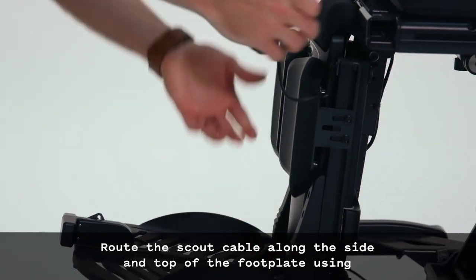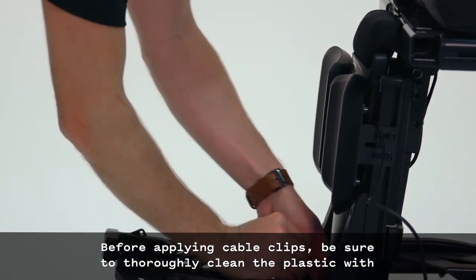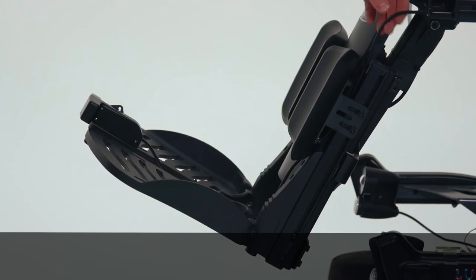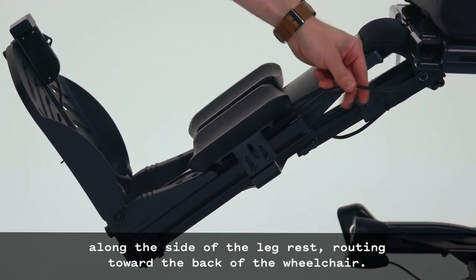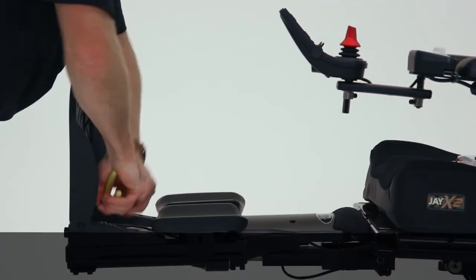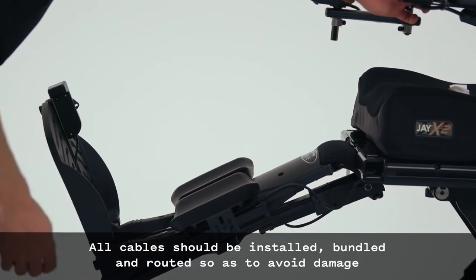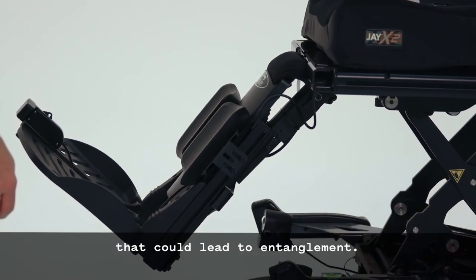Route the scout cable along the side and top of the footplate using zip ties and cable clips as needed. Before applying cable clips, be sure to thoroughly clean the plastic with an alcohol wipe. Make sure you do not route the cable under the leg rest post. Raise the leg rest to its fullest extent and continue routing the cable along the side of the leg rest toward the back of the wheelchair, following existing cabling and cable clips where possible. Ensure there is enough slack in the USB cable so the seat and leg rest can move to their full extent without tension. All cables should be installed, bundled, and routed to avoid damage through pinching, dragging, and excess cable length that could lead to entanglement.